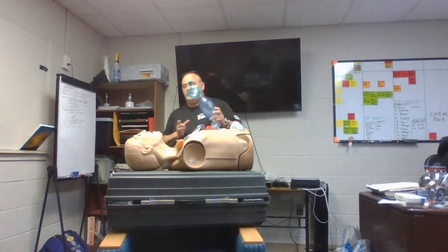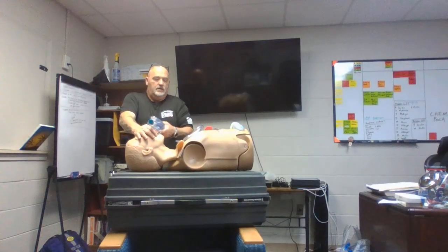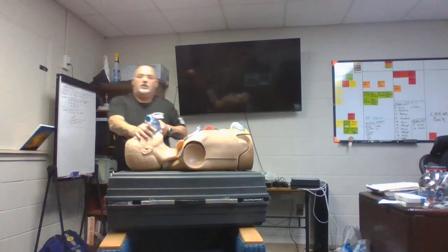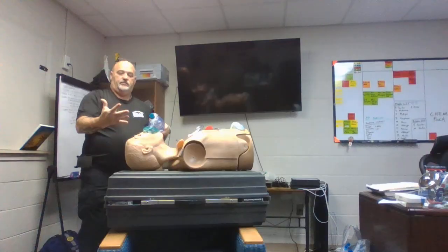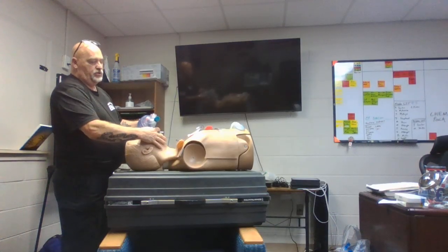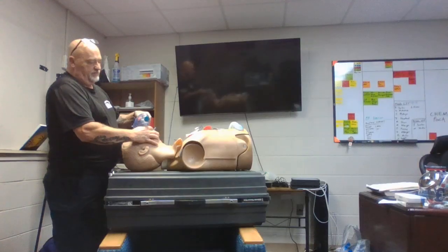And we see this a lot. They'll come in, they'll take that bag valve mask and they push it down, right? I'm like, are you getting good compliance? Well, no, because we're doing it incorrectly. You don't push this down on the patient. You place it. You remember the CE, right? Make that C and that E. You're going to pull that patient's airway up into that mask. And we're just going to squeeze just enough to get the chest to rise and fall.